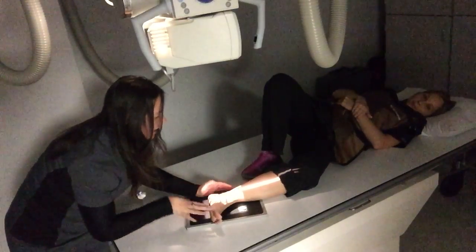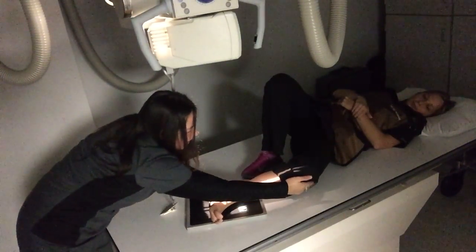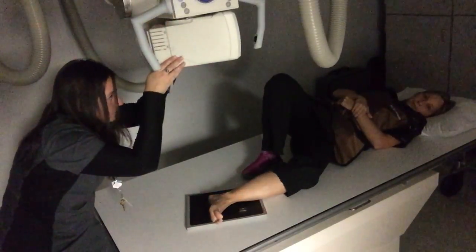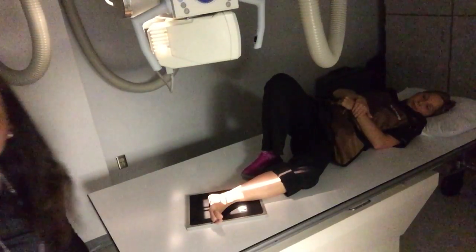So I want her leg, her foot, and her ankle all lateral to make it even. So her knee is going to be up off the table a little bit during this projection. All right, that collimation looks really good. So I'm going to expose there as well at 70 kVp. And that is your ankle.